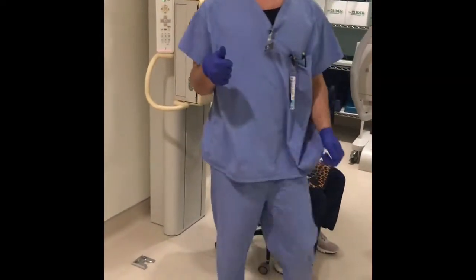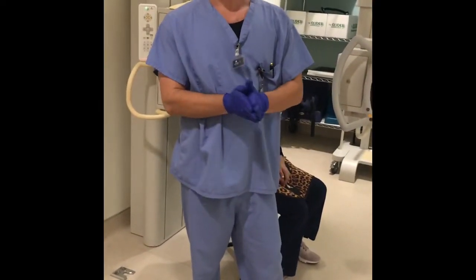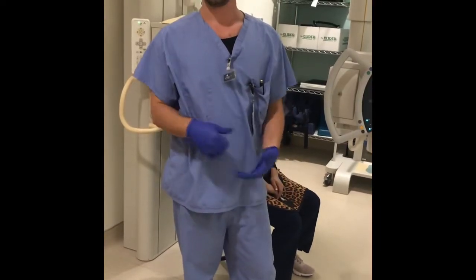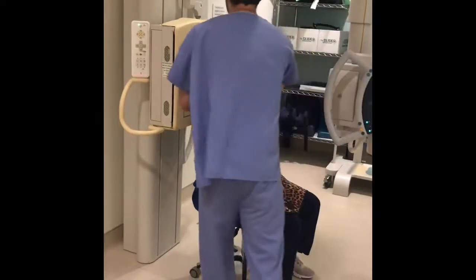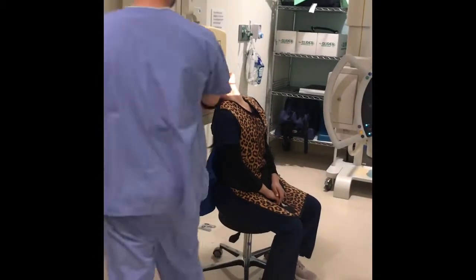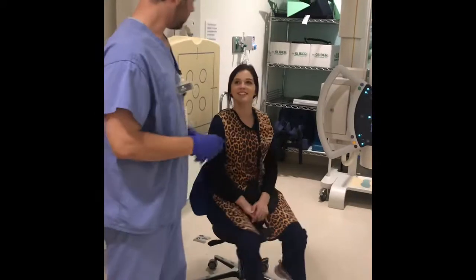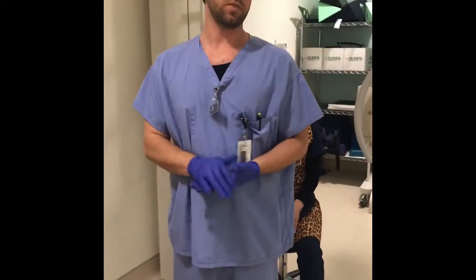And so I'm going to kick the technique up a notch. I'm definitely going to do a little bit more KV because we're going through the occipital bone that's quite thick. So I'd say 85, 80-ish, maybe 20 mass would be a good digital technique. So then, all right, hold your breath. X-ray. All right, ma'am. Relax. I'm sorry, was that uncomfortable? Okay. So that is our 4 views for the sinuses.